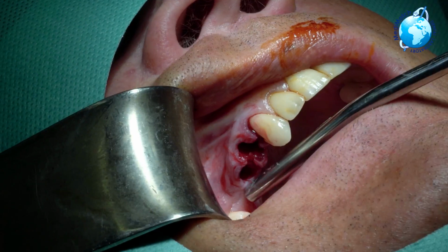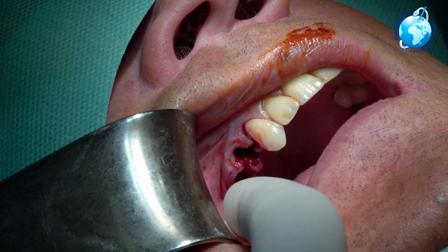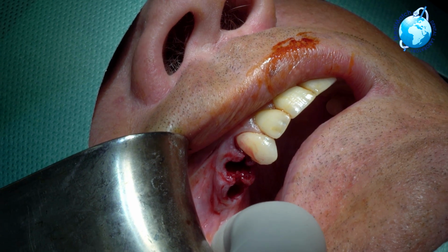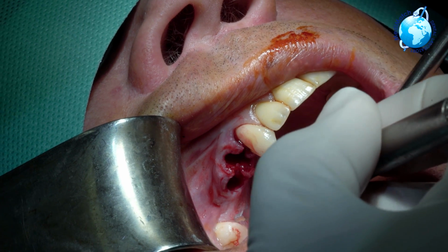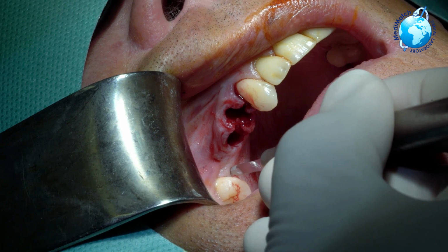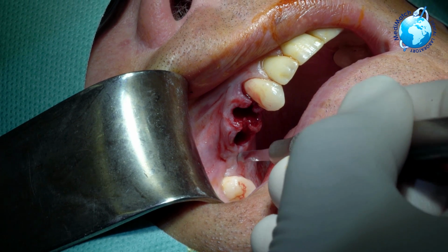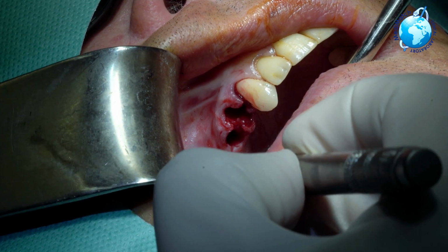Okay, great. So now we've done the extractions of the first premolar and the second premolar roots. We're going to place an immediate implant in the position of the 4, and we're going to do a sinus lift in the position of the 6 and place another implant. So I'm starting off with an incision slightly off the crest, going towards the palate. Alan, are you okay? And the incision comes forward. I'm using a double-sided blade, a number 15 Morton blade there, modified Widman just to release the tissues.